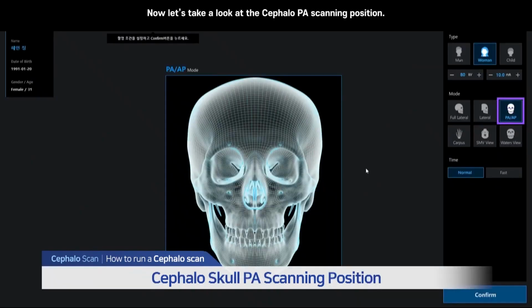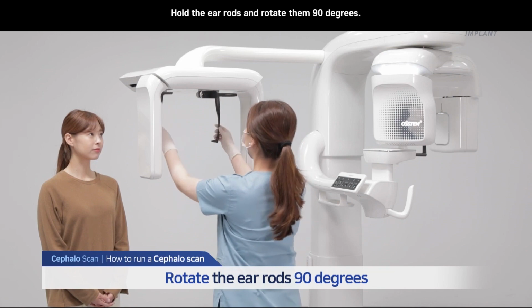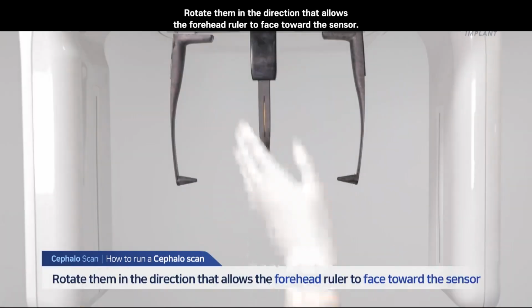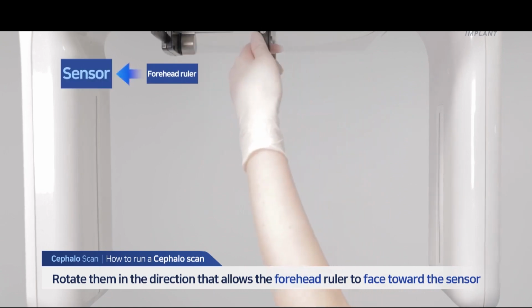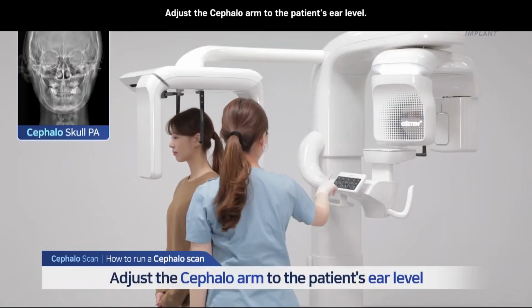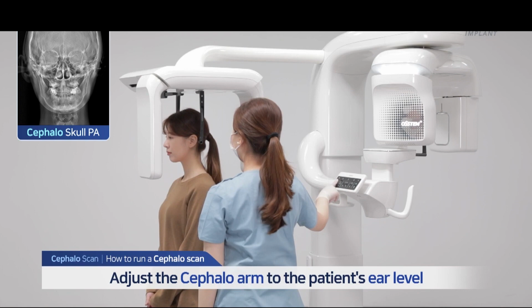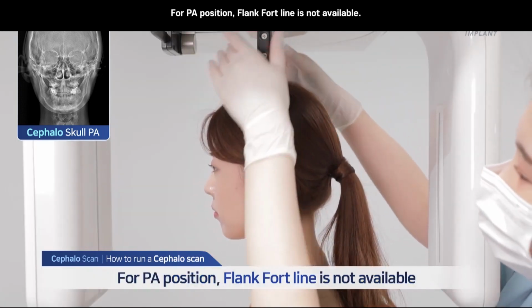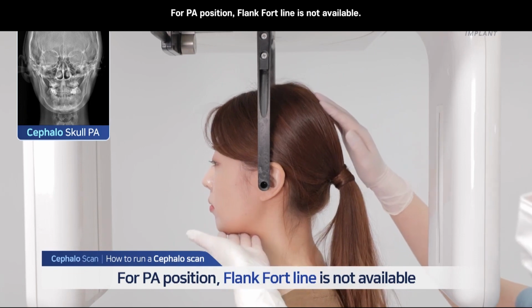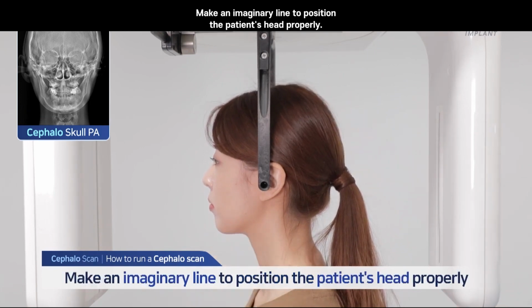Now let's take a look at the cephalo PA scanning position. Hold the ear rods and rotate them 90 degrees. Rotate them in the direction that allows the forehead ruler to face toward the sensor. Adjust the cephalo arm to the patient's ear level. Insert both the ear rods into their ears and fixate them. For PA position, the Frankfort line is not available. Make an imaginary line to position the patient's head properly.